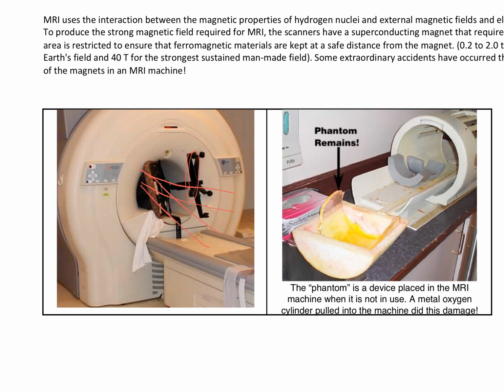You even need to keep these machines apart. Some practices that have more than one MRI machine will put one in another location, far enough away that the magnetic field does not affect the other machine. And you can see the damage caused here by the machine. And here's a chair that was left in the room, perhaps when a technician turned the machine on.